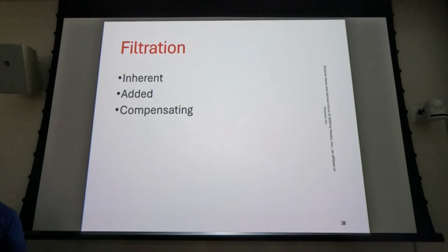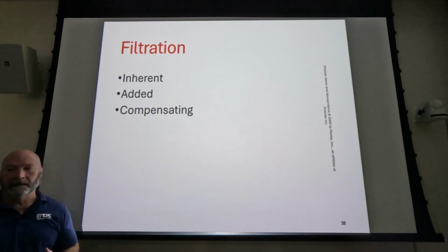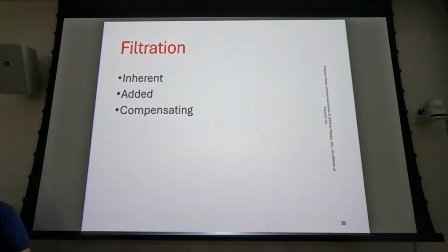So that would be the glass or metal envelope, and then the oil to cool the X-ray tube, and then the port in the protective housing, and then the back of the mirror. If all that gets you up to 2.5 millimeters of aluminum equivalent, and that's the EQ at the end of that, then you don't need anything else. If it doesn't, then you need something else to get you there, right? So it's got to be at 2.5 millimeters of aluminum equivalent. And what they'll use is just sheets of aluminum, just add it above the mirror.